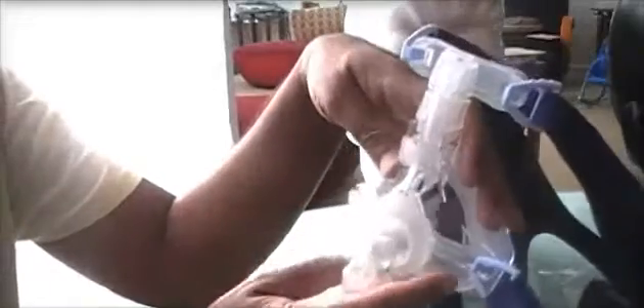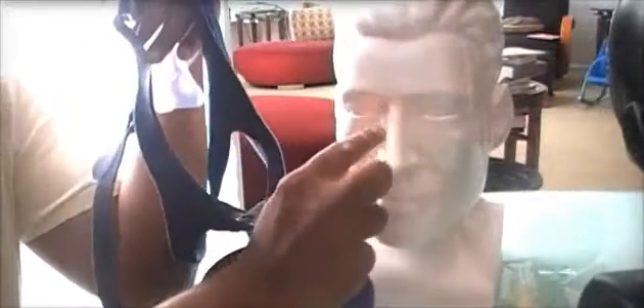Speaking of headgear, I want to show you an example of something that happened to me. This is a full face gel mask made by DeVilbiss — a very good mask — but the headgear was too small for me and was cutting, creating pressure points and bruising. All I did was take a headgear from a Mirage Quattro full face mask and put it onto this one. Do you see this blue clip? I just undid it and swapped the headgear. Change the headgear size or use a different brand's headgear if you have to.